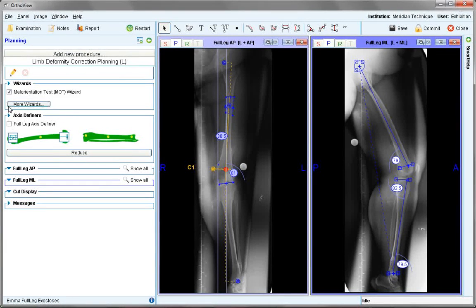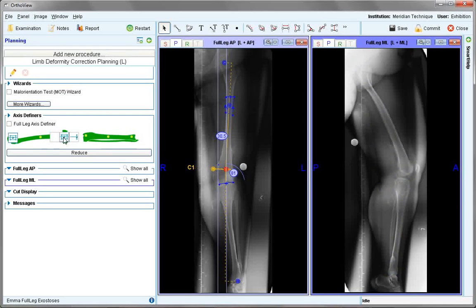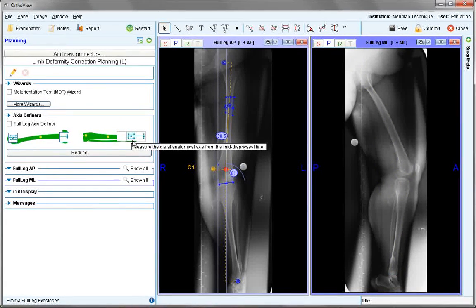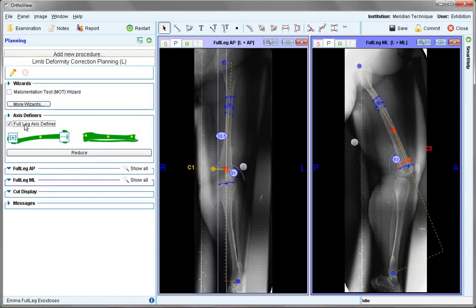Remove the wizard and use the axis definers — just anatomical and no mechanical this time — at the hot spots to reference the different joints and diaphyseal shafts. Turning them on allows you to see a diaphyseal shaft definer and a joint definer in place.